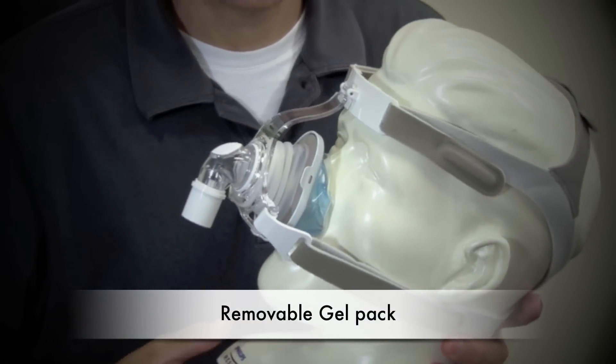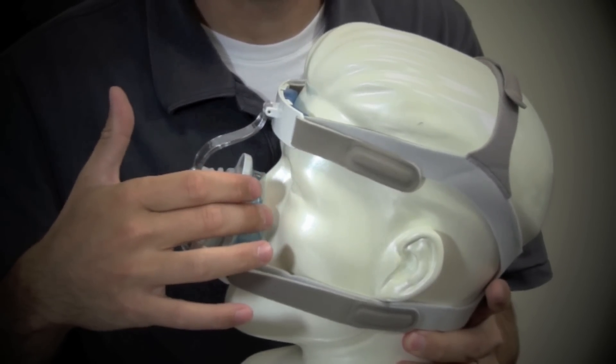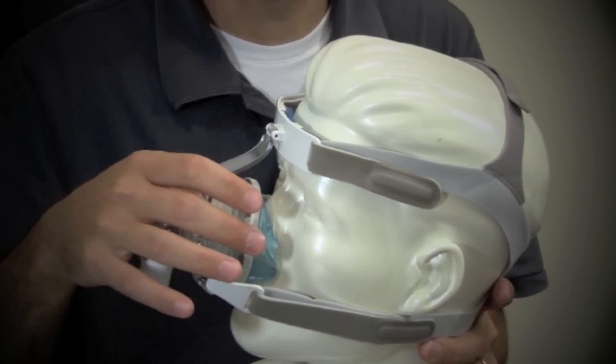This premium gel, which is right in here, features a thin, form-fitting outer silicone flap, which helps create a self-adjusting seal. The gel itself is very lightweight, soft, and will contour around your nose nicely.